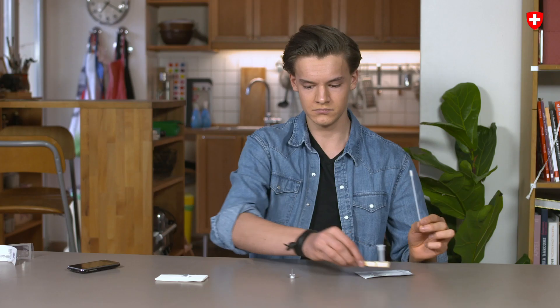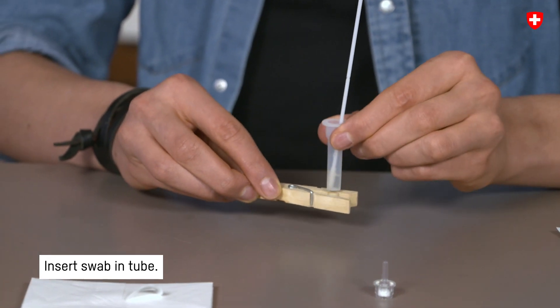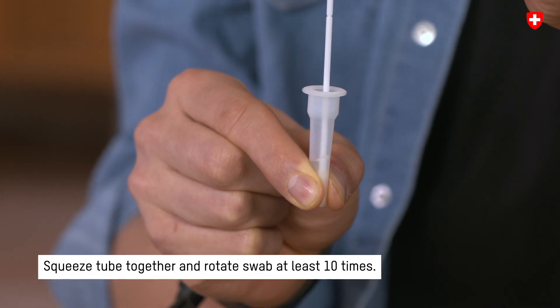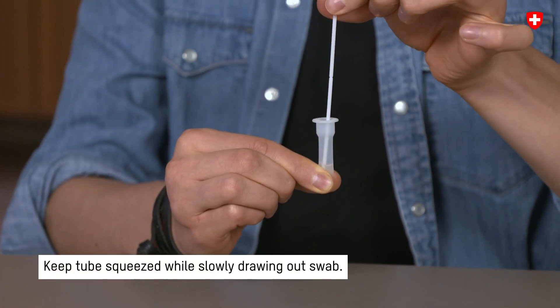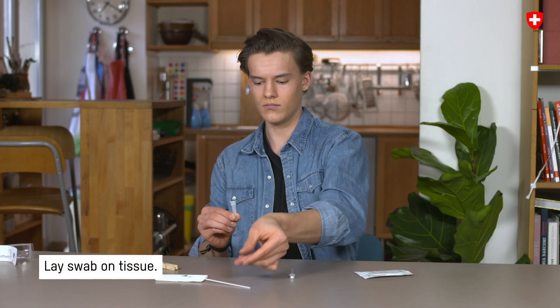Step 4: Put the sample in the buffer solution. Insert the swab into the prepared tube. Squeeze the bottom of the tube together and turn the swab at least 10 times. Then keep the tube squeezed together and slowly draw out the swab. Lay the swab on the tissue.